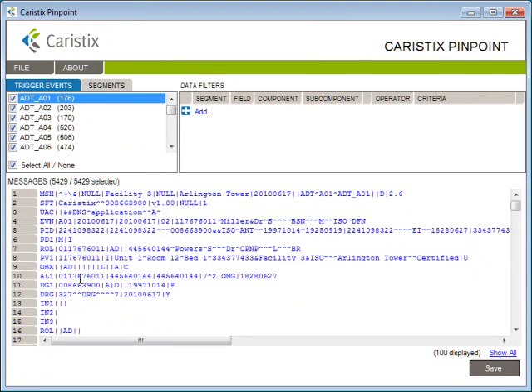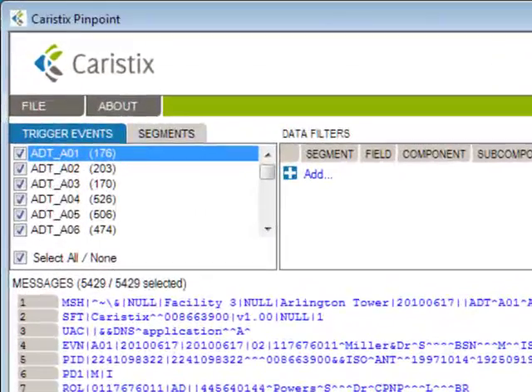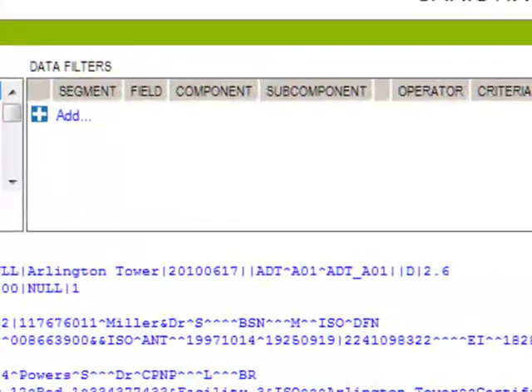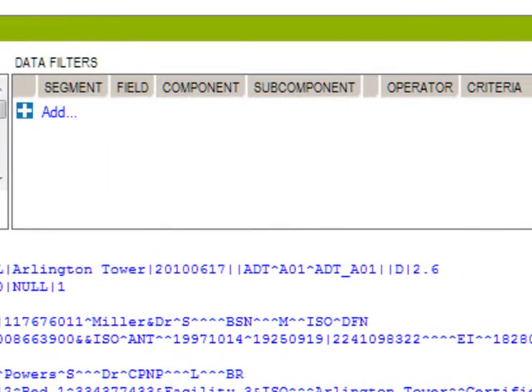Let's try filtering some messages. There are two ways to filter messages: you can focus on trigger events and segments, or you can filter on data values using data filters.